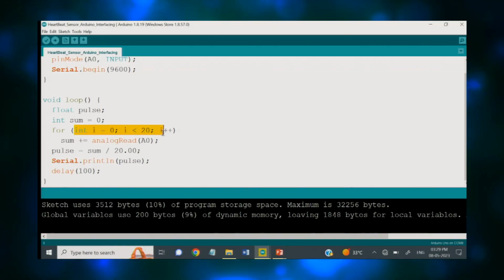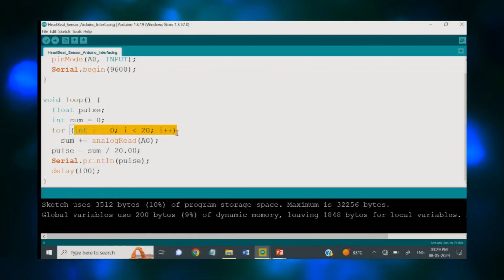So, in order to avoid that noise, we have added a sequence here, which adds up the previous 20 pulses and creates a sequence out of that while eliminating the noise. So, if a value is averaged from the sequence of 20 pulses, only that will be displayed on your serial monitor or plotter.